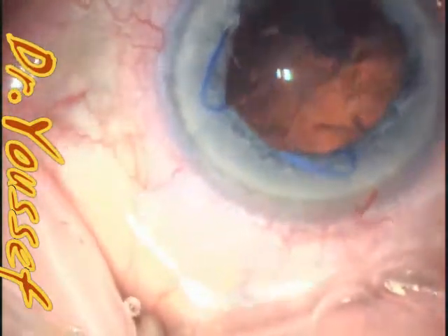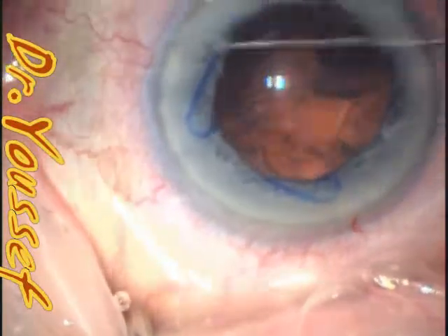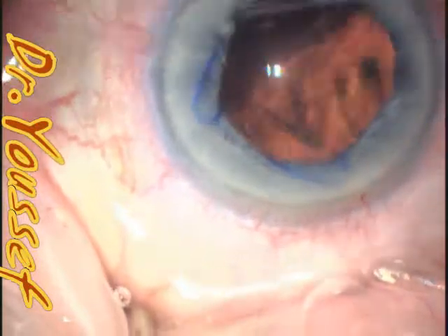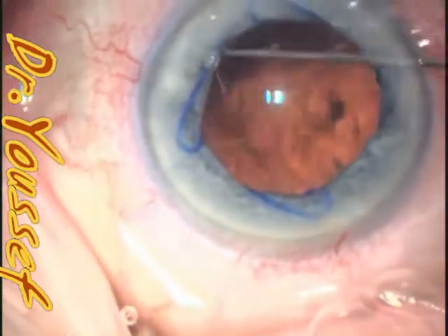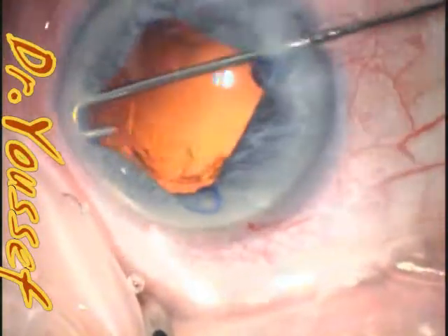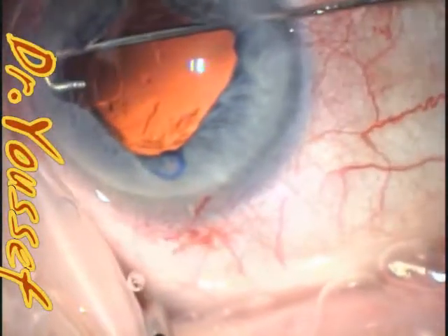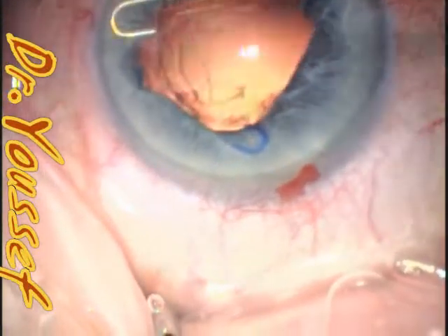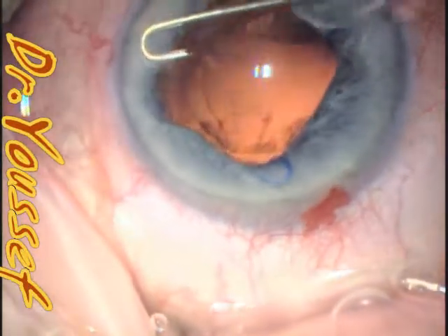Now this is the J-Cannula starting here. It's going very well, no problems. Doing the cleanup very well, but we'll see what's going to happen here. See, now it's in an area that I don't see. So this area here, I found that okay, this is not in the proper position. So I dragged it slowly so that it doesn't hook.